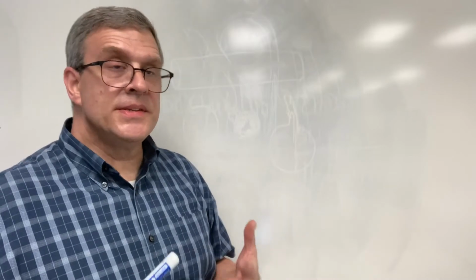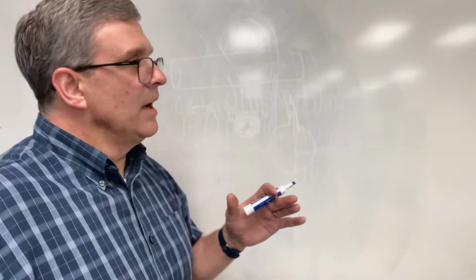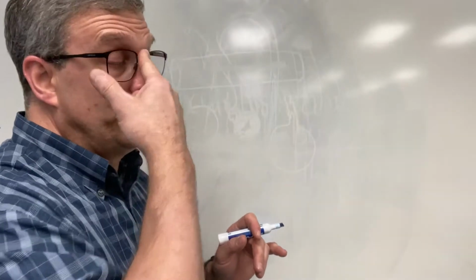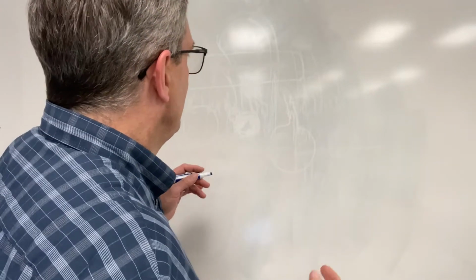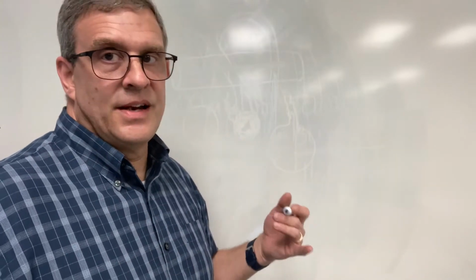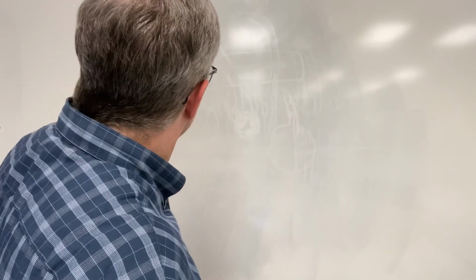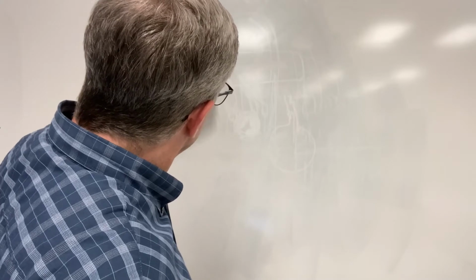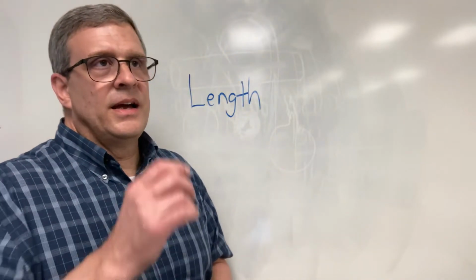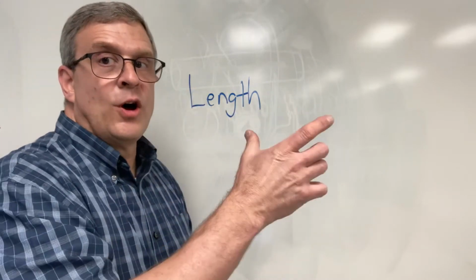Now, we talked about resistance in terms of the radius or the cross-sectional area, and that's our biggest contributor. But Poiseuille's law tells us that there are several things that affect that. The length of the tube. So we think about things like an endotracheal tube that's really long.